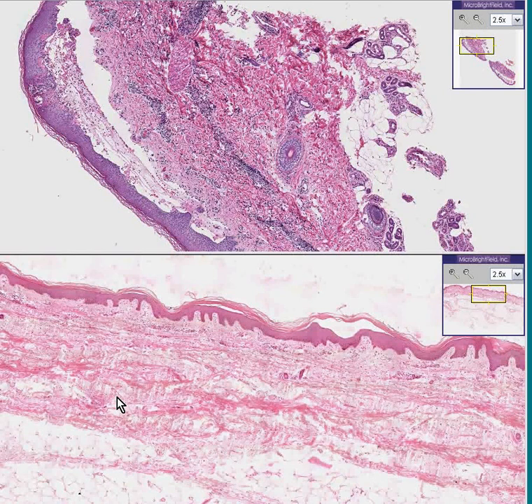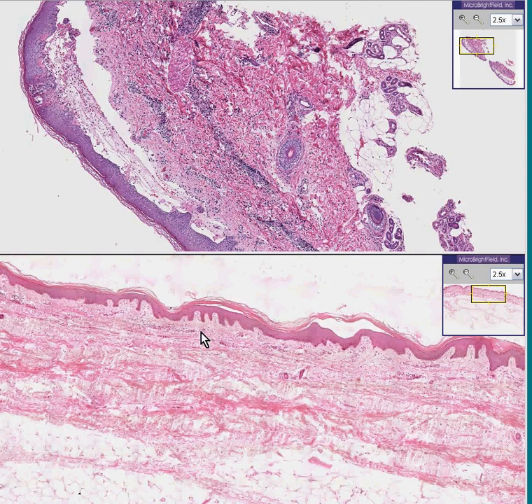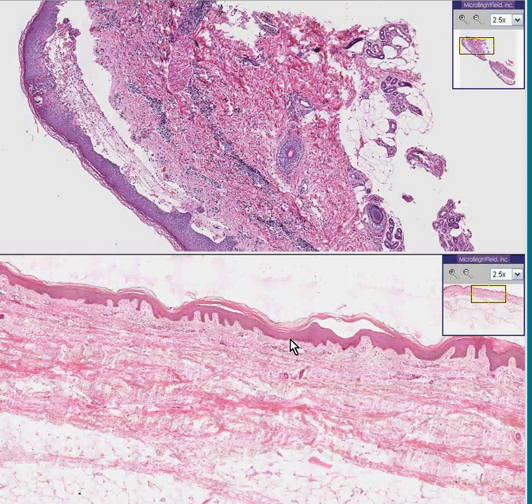I direct your attention to the lower field in which we have perfectly normal skin. You can see the papillary dermis, you can see the reticular dermis, you can see the rete pegs of the epidermis, and you can see the maturation from the basal layer to the stratum corneum.